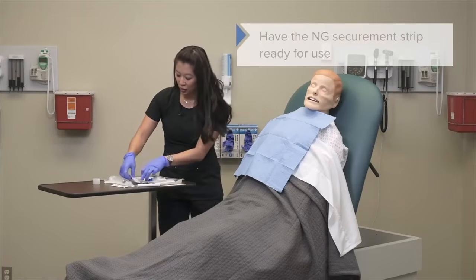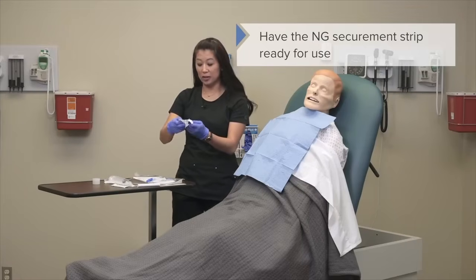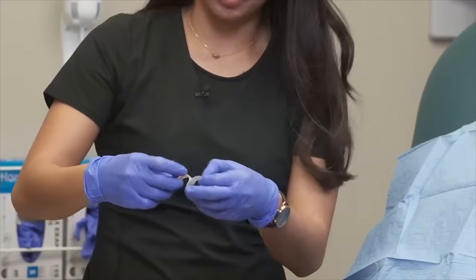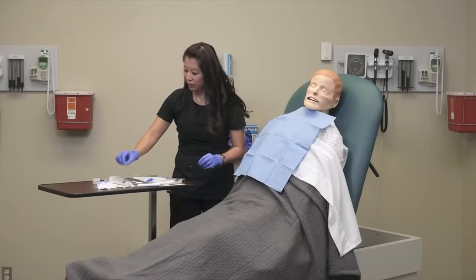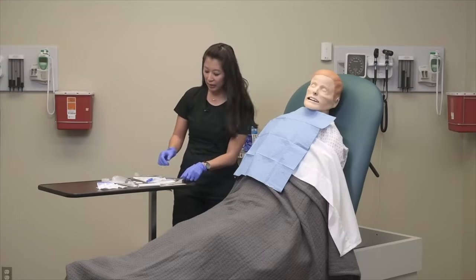Okay, and before I start that, I'm going to go ahead and get my nasogastric strip ready. This is going to help secure the tube once I've placed it. You're going to see why that's important here in a bit. Okay, so I think we've got our lubricant, we've got that ready. Now I can go ahead and insert.